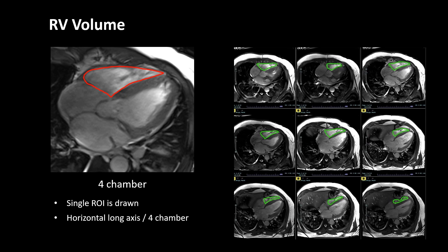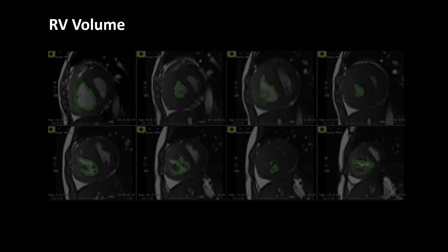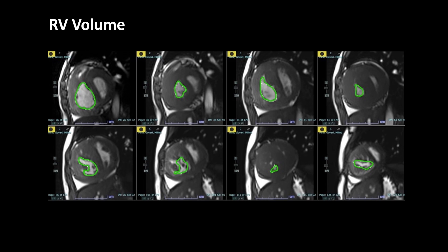For the right ventricle, we usually draw the ROI on the 4-chamber view. But sometimes when RV walls are thickened, it can also be drawn in short axis just like the LV, and if you draw the epicardial ROI, you can also get RV mass.